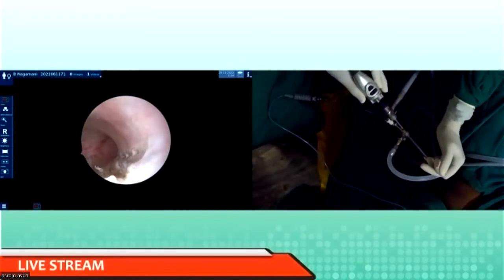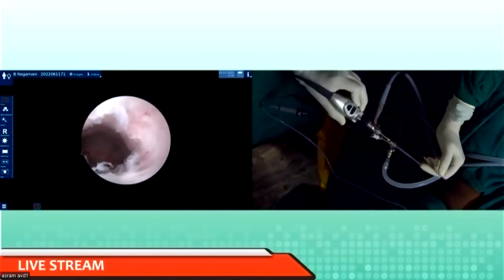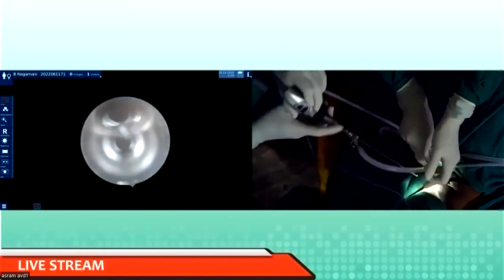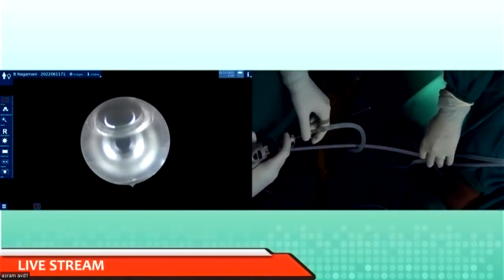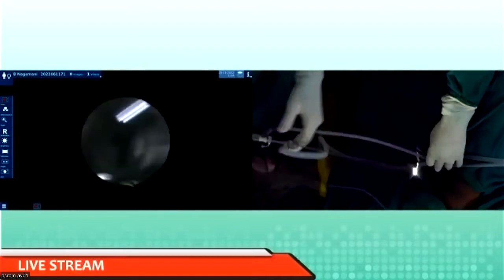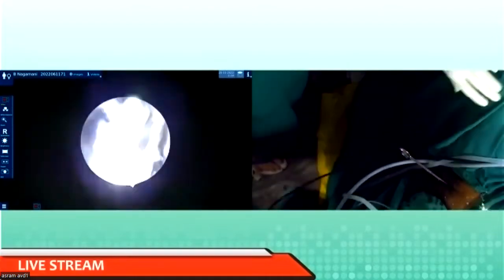So how much depth will you do that lateral metroplasty? That depends on my ultrasound. So at least you should leave behind at least 8 millimeters of myometrium. Now it is for someone to ask. Listen. Madam Tripura Sundari, madam.